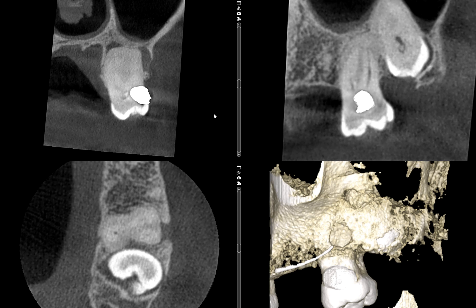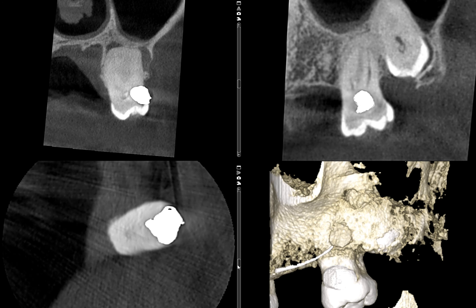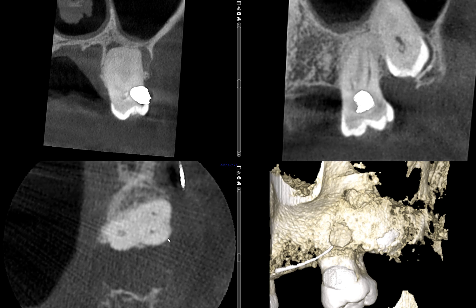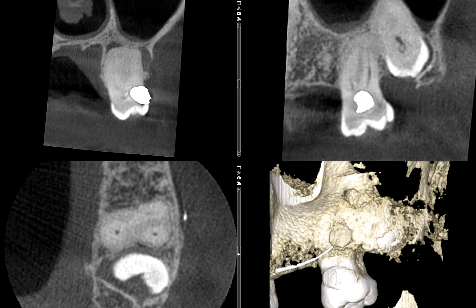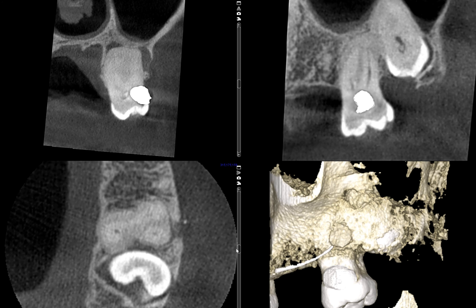Let's take a look at this in the axial view. Let me zoom in just a little bit and then we'll go from the crown and move toward the apices. Pay close attention to the outline of the root. As I move toward the apices — let me scroll through a couple more slides — there's something interesting. Let's look at the palatal root. This might have been the original outline of the root, but now we see this enlarged appearance. We can draw the PDL space, and the radio density of this material is slightly different from the original density of the root.